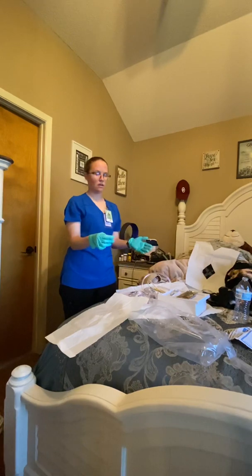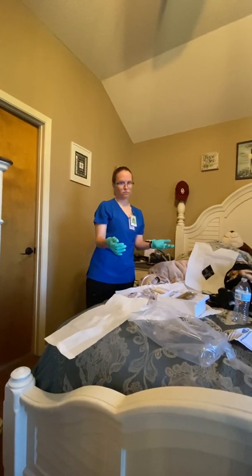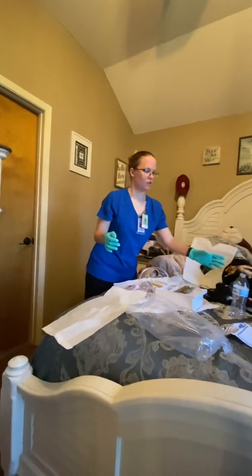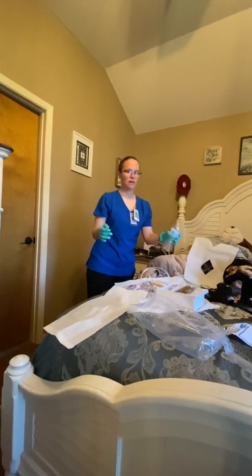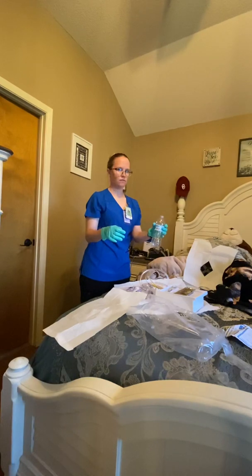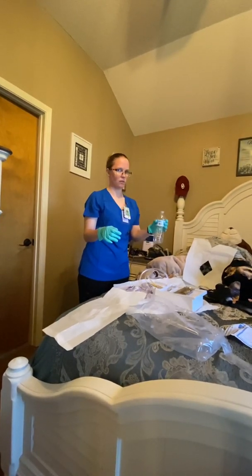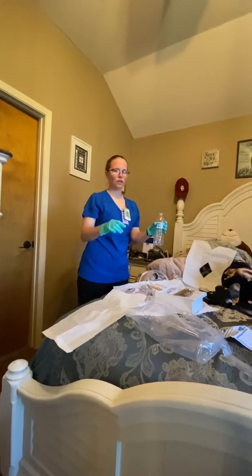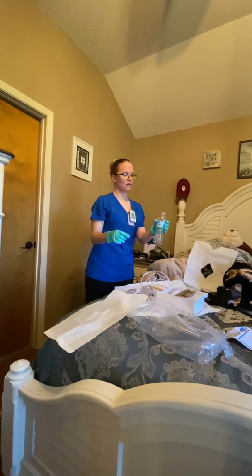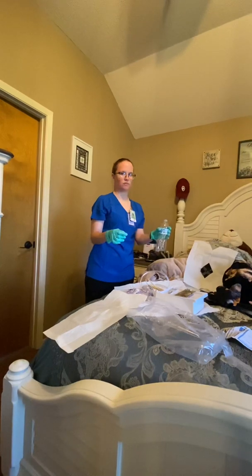Now we're going to cleanse the meatus. We're going to perform it on a male first. With our non-dominant hand, we're going to grab the penis just below the glans. Now this hand is contaminated, so our left hand has to stay on the penis. If the patient was uncircumcised, we'd have to pull back the foreskin, but the patient is circumcised.